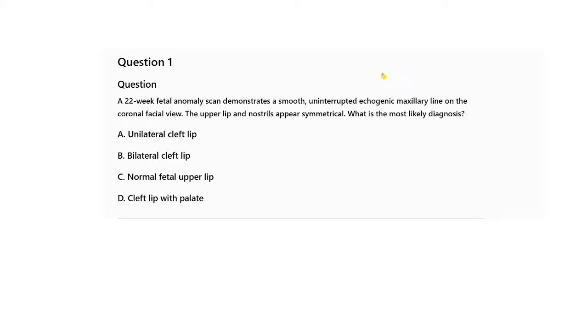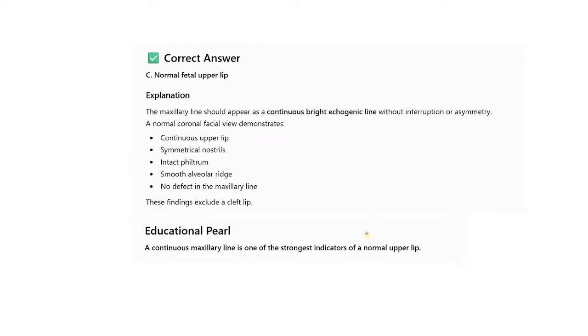So the correct answer is C, normal fetal upper lip.